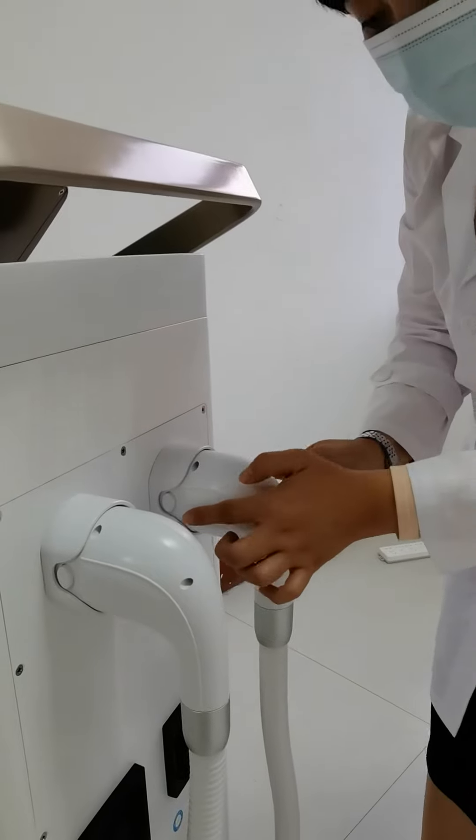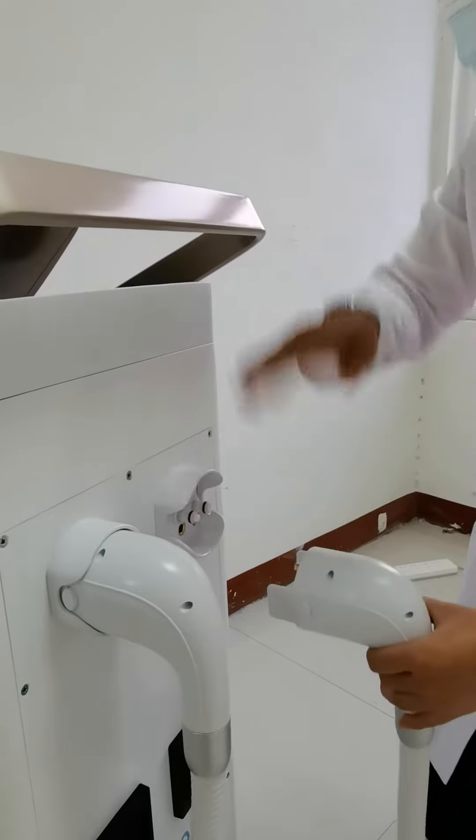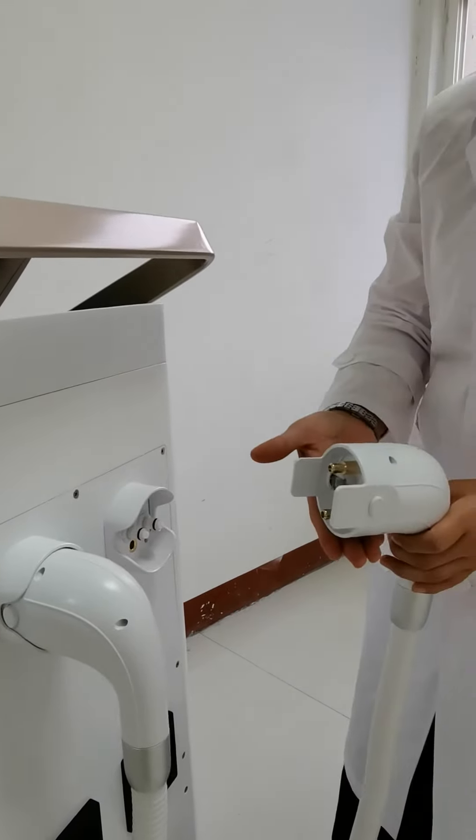If you want to take it off, there are two buttons. Press the button and move up and down. Then it will be removed easily.